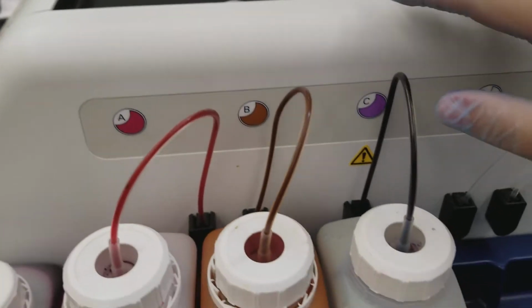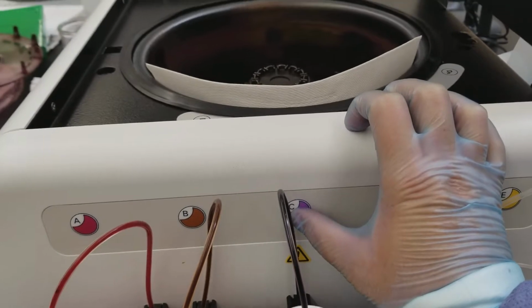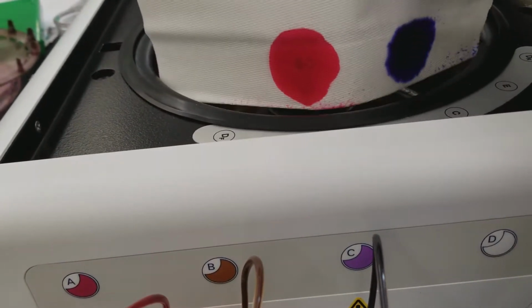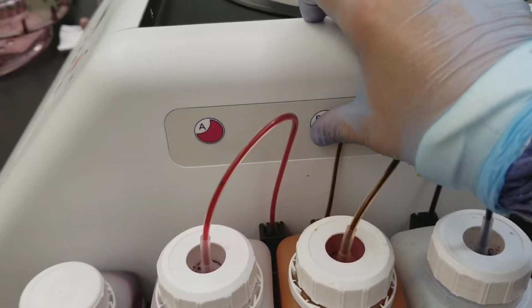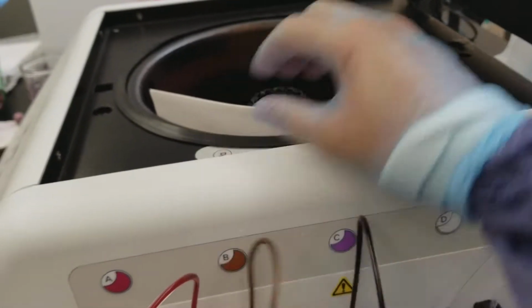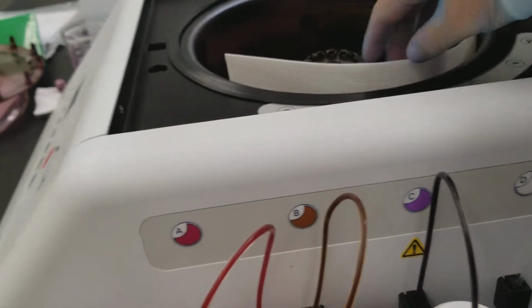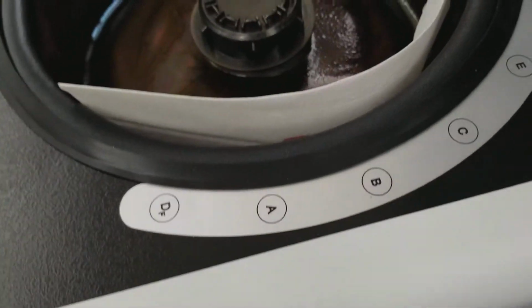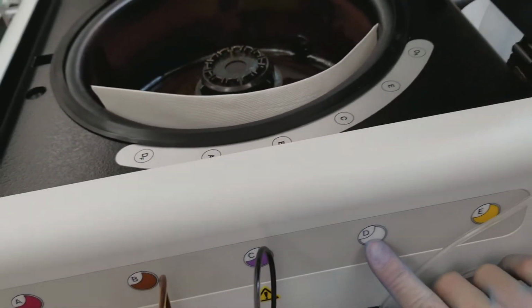Let's test the primary stain real quick. All right, you saw it move, so that means something did come out. That's perfectly circular. Excellent. All right, let's do the B. This is the mordant, which is the iodine, sorry. That looks great too. All right, and the distilled water, if you look, it's actually on this side, so that's kind of funky. You wouldn't expect it to be there.